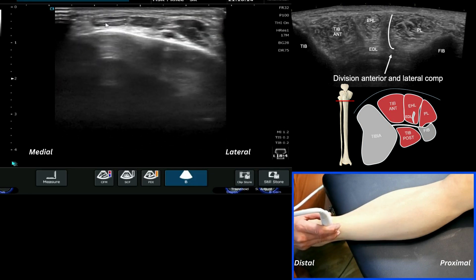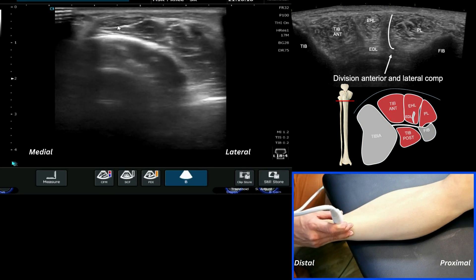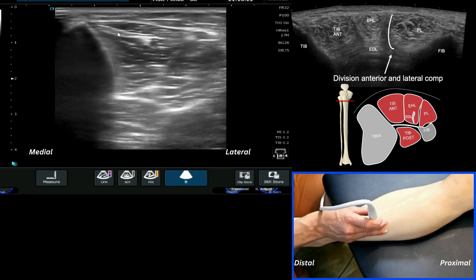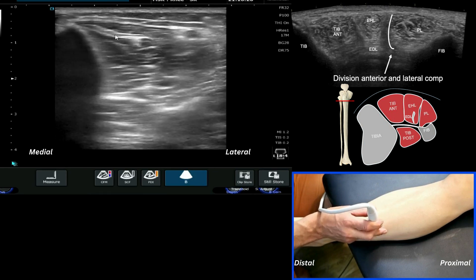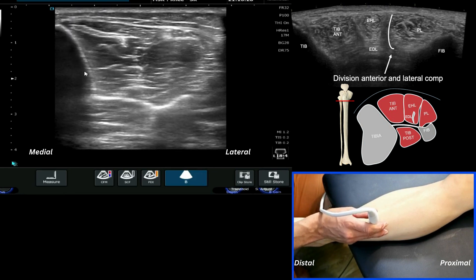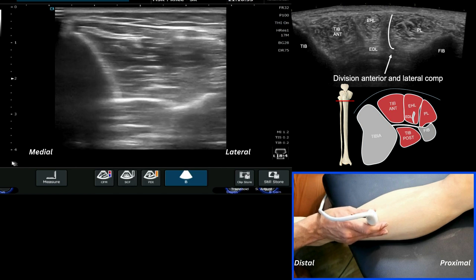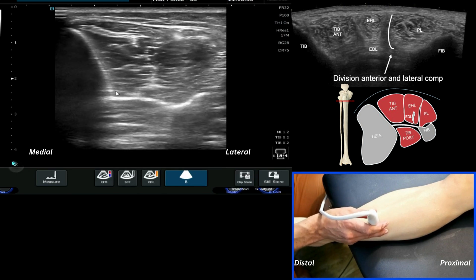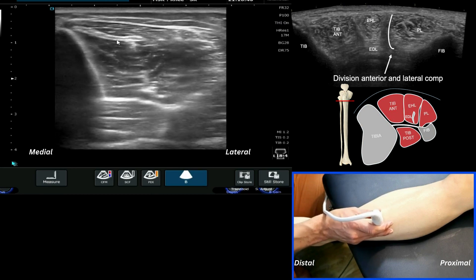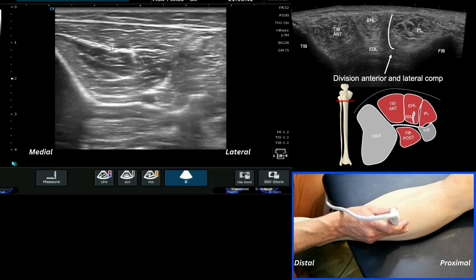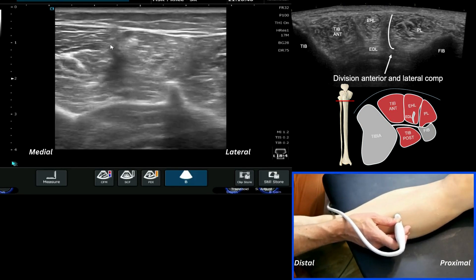At this point you can come down a little bit further to get your bearings, and we can see the clearly outlined tibialis anterior. As we keep coming up the leg, this forms the left side of your screen — the medial border. You can see the tibia here on the left; this is all bone. It's a short axis view, and we've now got the tibialis anterior tendon starting to thin out as it comes into more substantial muscle bulk.